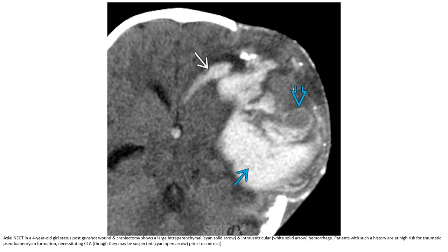Non-contrast enhanced CT in a near 4-year-old with status post gunshot wound and craniotomy showed a large intraparenchymal and intraventricular hemorrhage. Patients with such a history are at high risk for traumatic pseudoaneurysm formation, necessitating CTA.